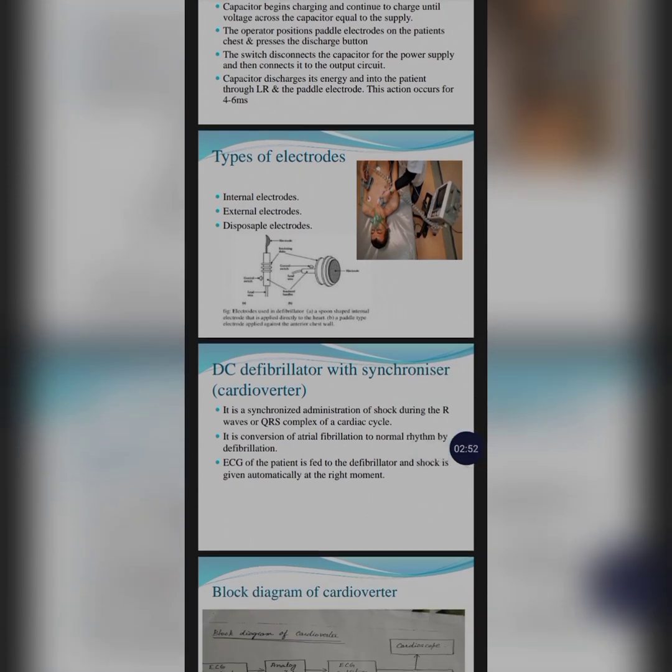Types of electrode: internal electrode, external electrode, disposable electrodes. DC defibrillator with synchronizer.